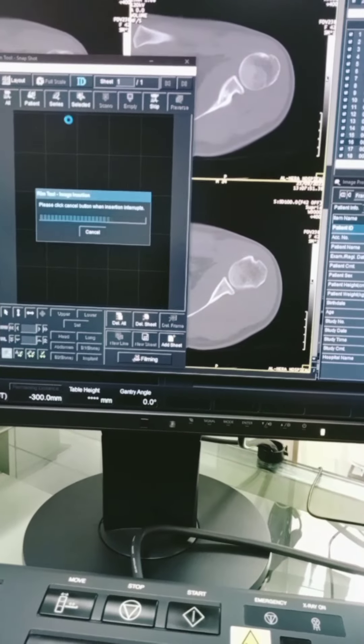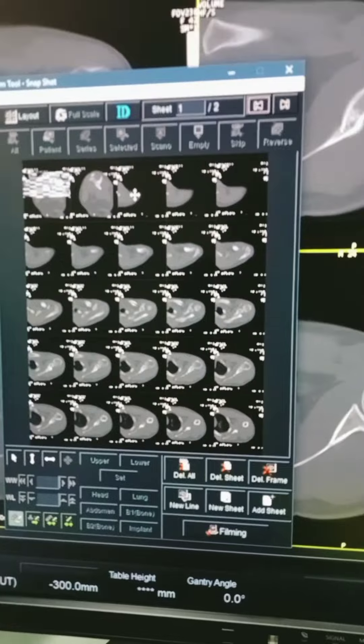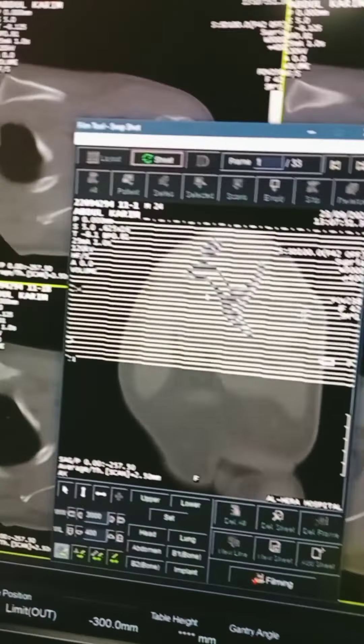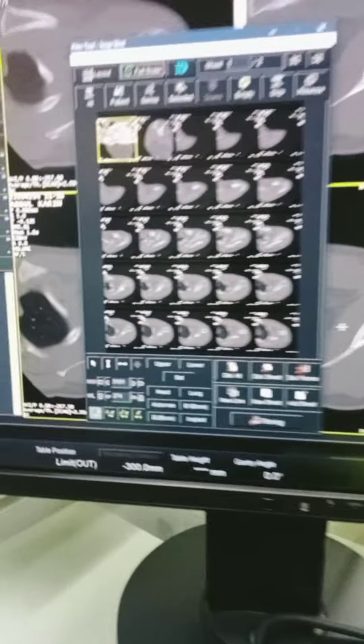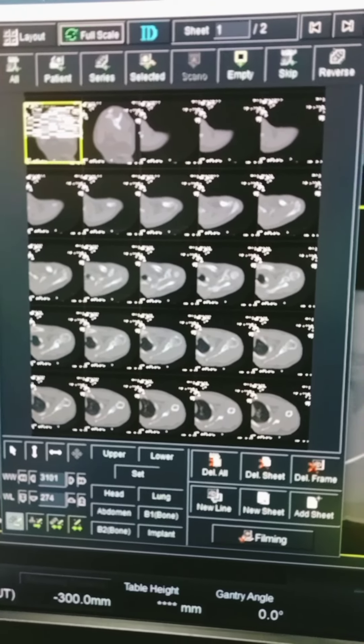This is the same machine that has a full film available. XL Image Filming System.